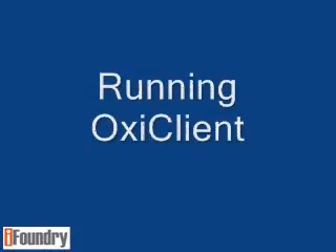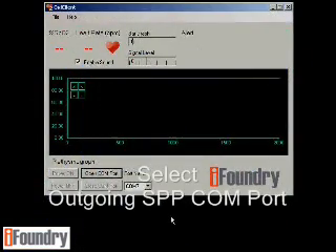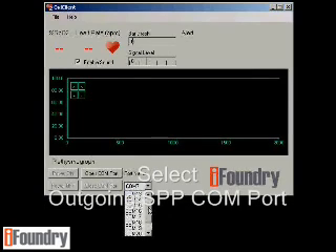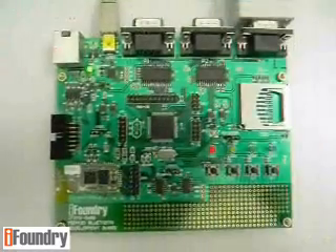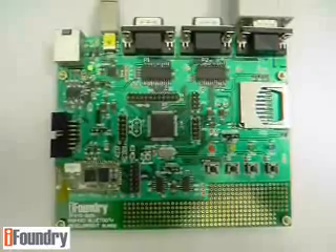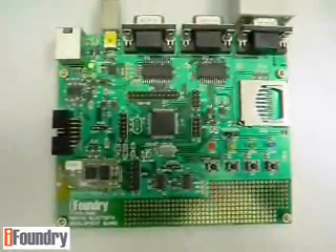Now let's run the OxyClient. Select the port name — this should be the outgoing SPP COM port created during the pairing process. Click 'Open COM Port.' You will notice that only the red LED is blinking and the yellow LED is off, which means the SPP connection is already established.